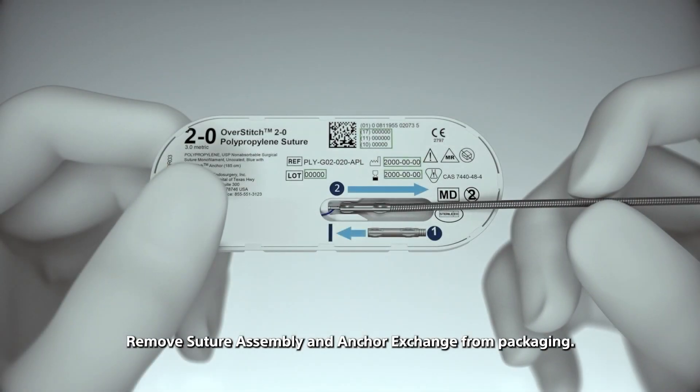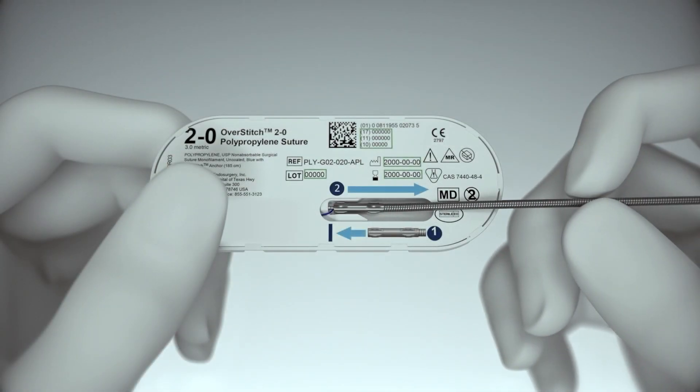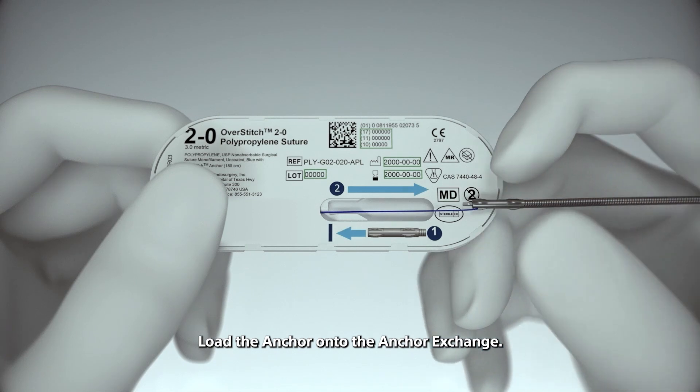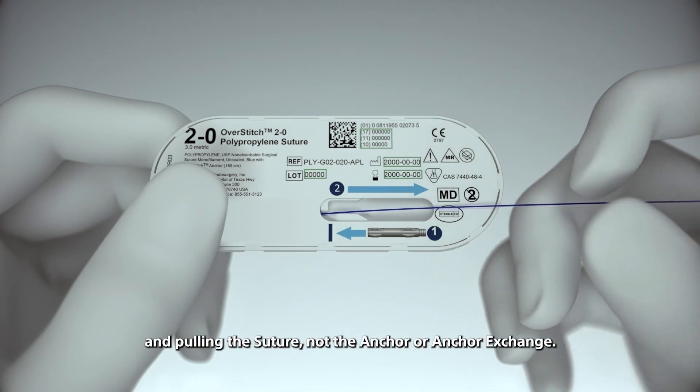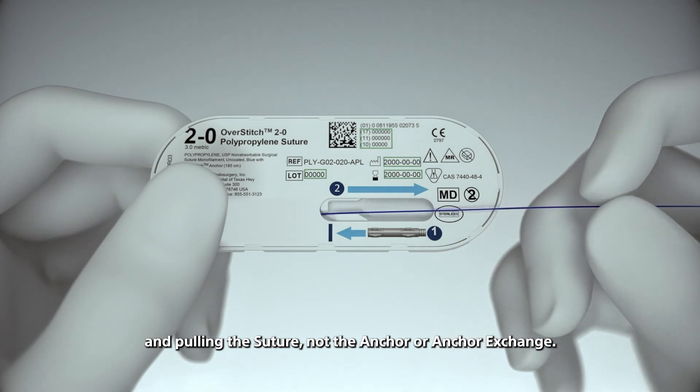Remove suture assembly and anchor exchange from packaging. Load the anchor onto the anchor exchange. Remove suture from sutured cartridge by holding and pulling the suture, not the anchor or anchor exchange.